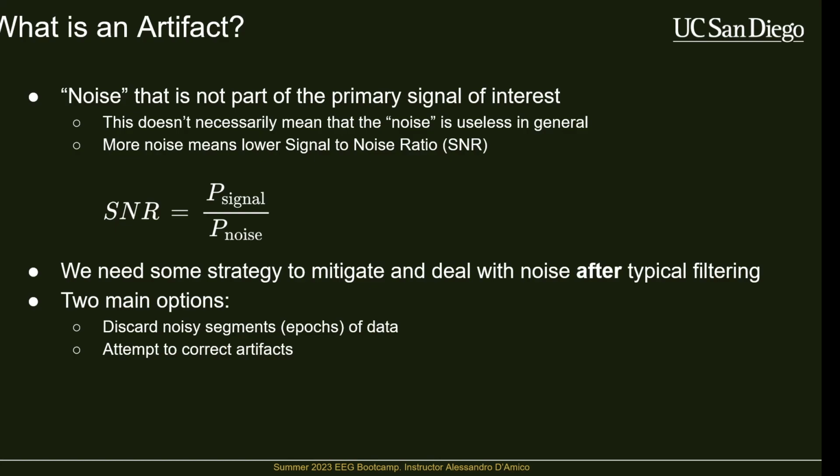I don't know how reliable that is with something like EEG or how reliable it is in general, but theoretically you could determine exactly when EEG is recorded if you have the raw signal of what the 60 hertz noise looks like at all times and then compare that to your 60 hertz noise in EEG. Theoretically you could do that. I don't know anyone who's done that, but anyway, all that to say is I'm calling certain things noise right now that are not necessarily useless.